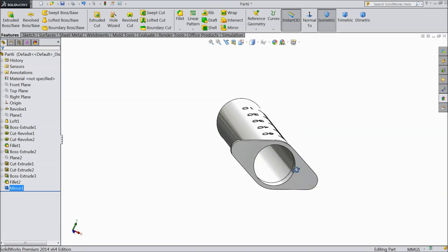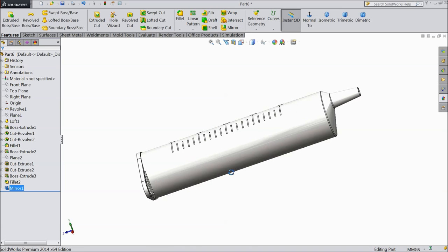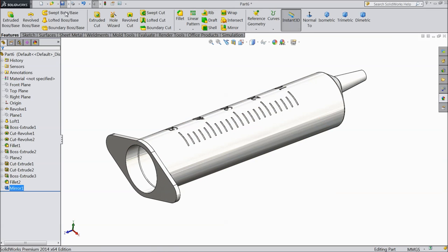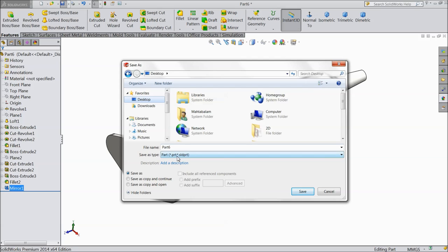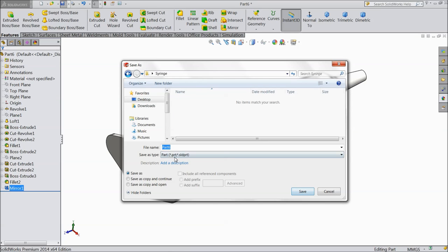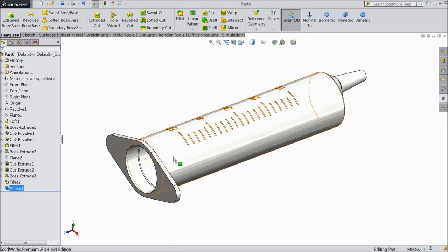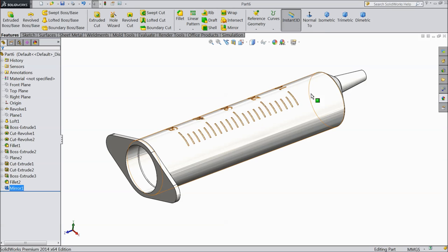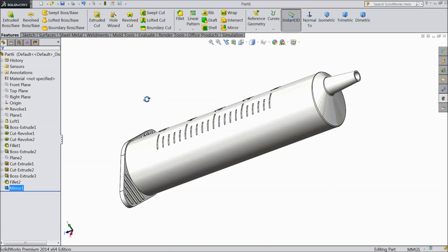Now our syringe body is ready. See this is the body for the syringe. Just save as on the desktop — create one folder named syringe, open and save this syringe body. Now let's move to our next part.